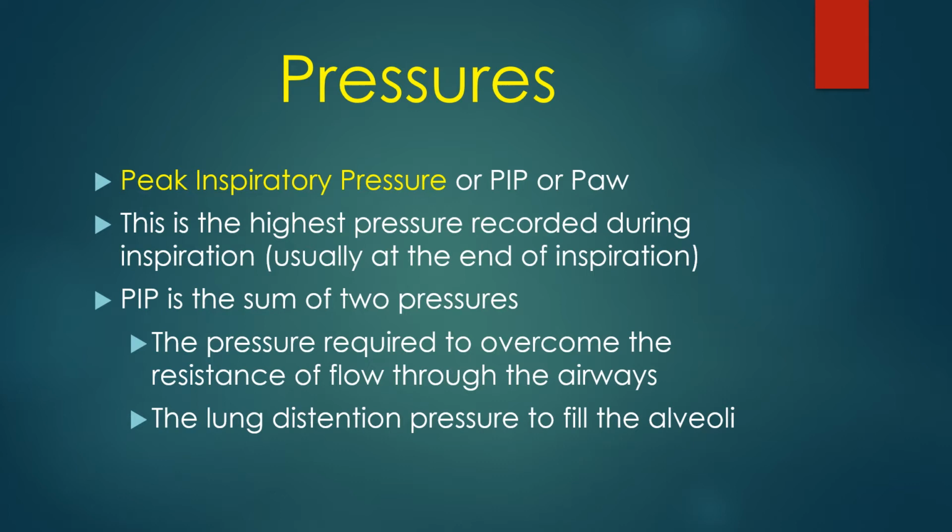You know, the ventilator is delivering a breath to the patient, and as the air goes into his lungs, the manometer is going to show the pressure is going up and up and up. And at the very end of inspiration, when the expiratory valve opens, that pressure falls back down. So we're looking at the peak inspiratory pressure, and we're going to document the peak inspiratory pressure.